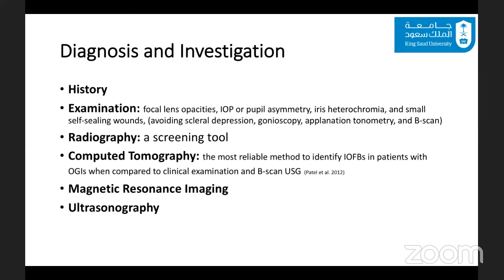Ultrasonography is a little bit guarded because of the fact that the eye is open in the acute situations.